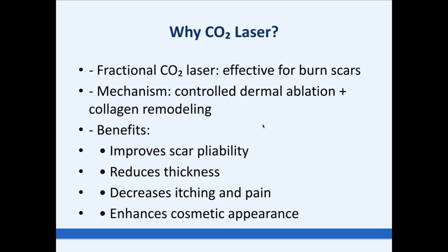When we have a big area of scars, I think it's the gold standard. We do controlled dermal ablation, and after that we have collagen remodeling. Benefits: improved scar pliability, reduced thickness, decreased itching and pain, and enhanced cosmetic appearance.